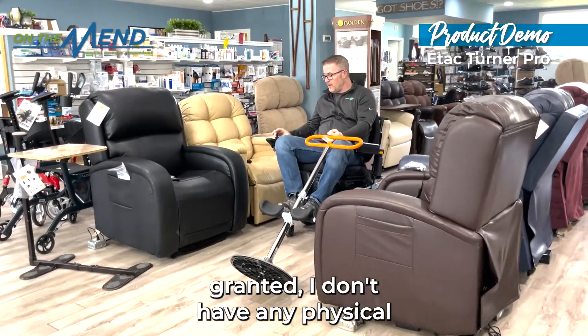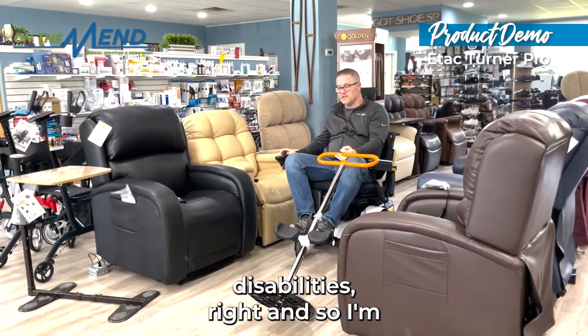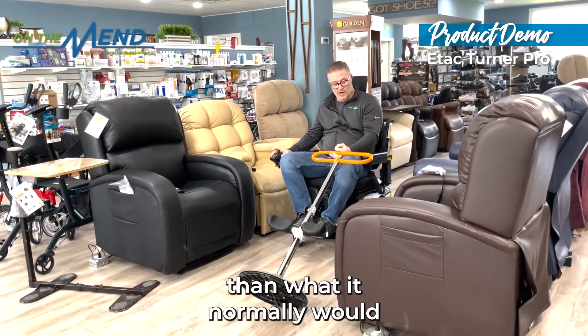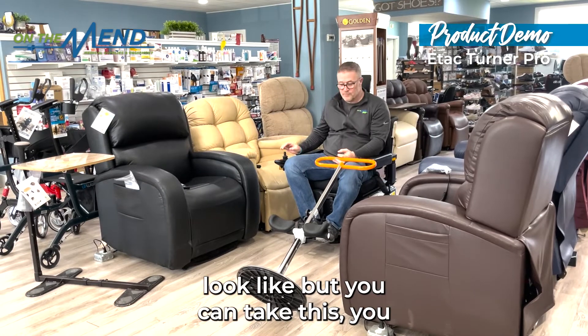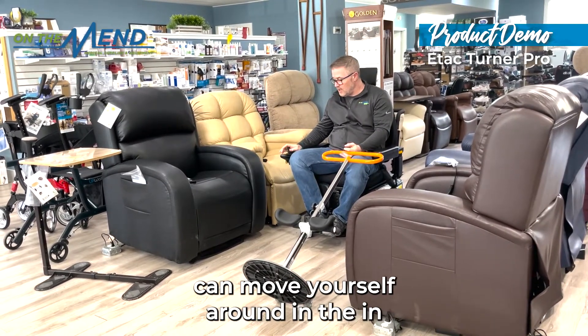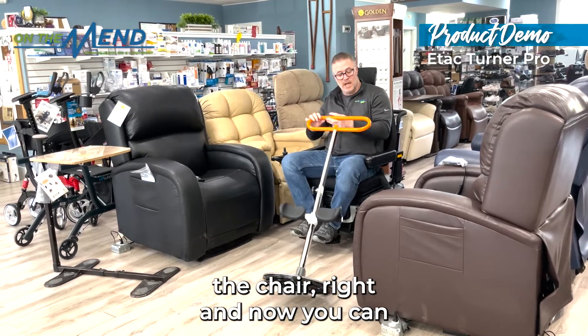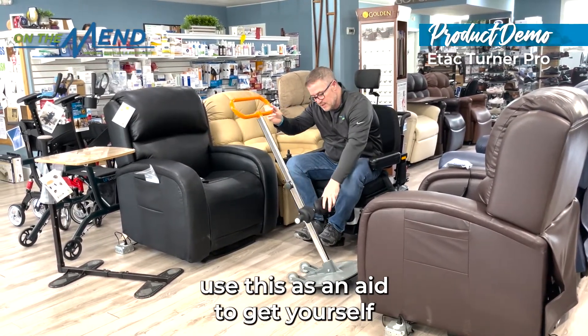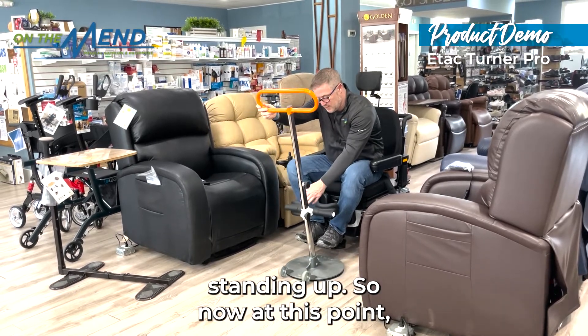Granted, I don't have any physical disabilities, so I'm sure I'm going to make this easier than it normally would look. But you can take this, move yourself around in the chair, bring this around to you, and use it as an aid to get yourself standing up.